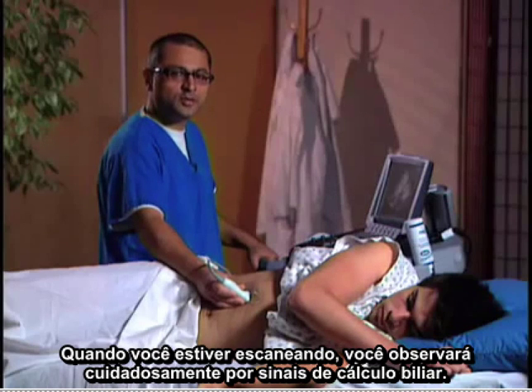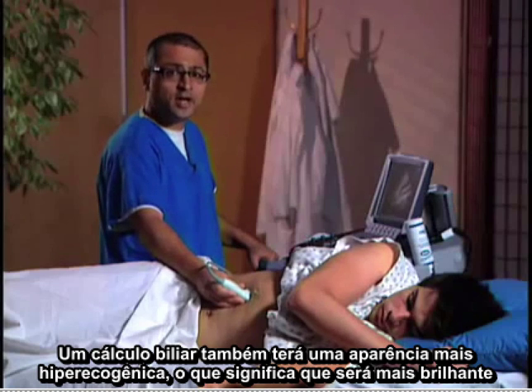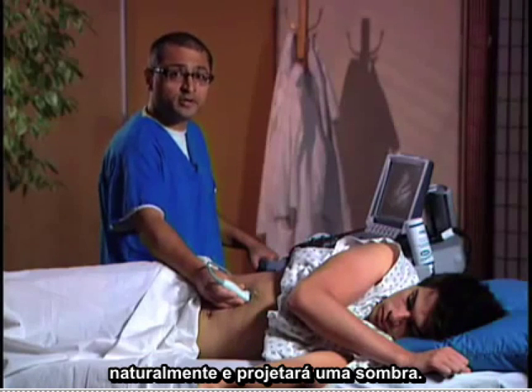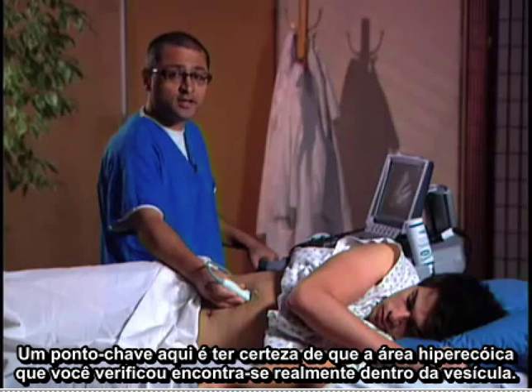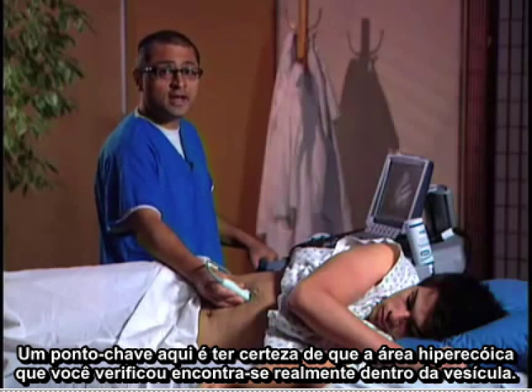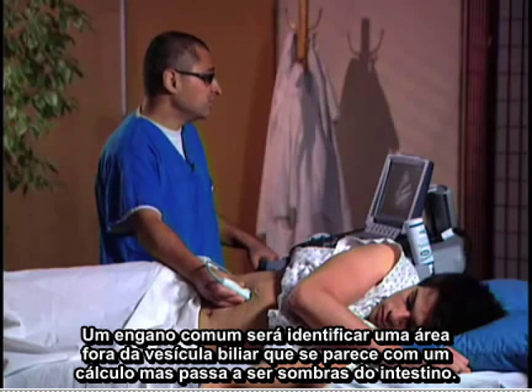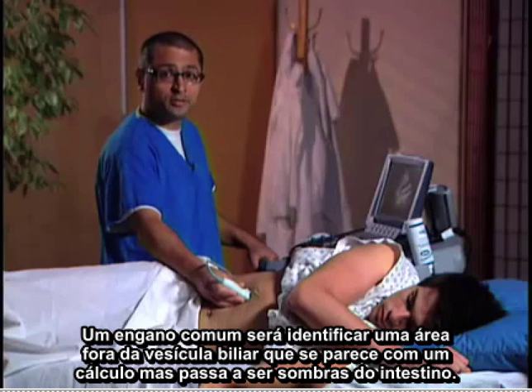When you're scanning, you're going to be carefully looking for signs of a gallstone. A gallstone will have a hyperechoic appearance, meaning it's going to be brighter in nature, and it's going to cast a shadow. A key point here is to make sure that the hyperechoic area that you're noticing actually lies within the gallbladder. A common mistake would be to identify an area outside the gallbladder that will look just like a gallstone, and that'll be a bowel shadow.